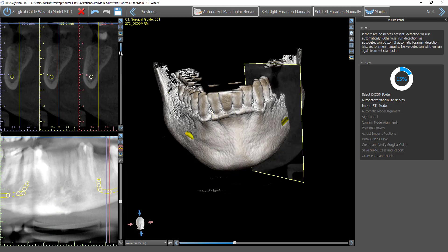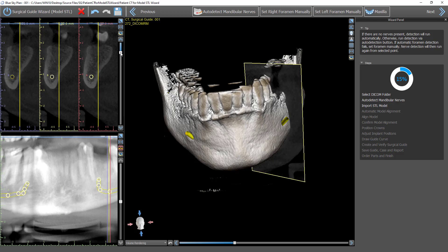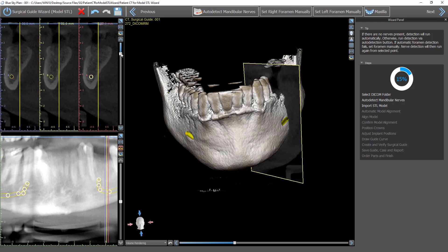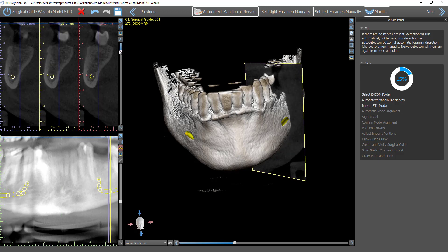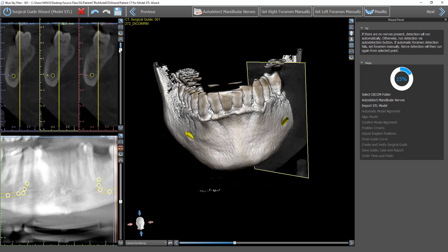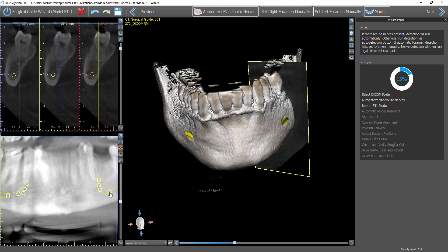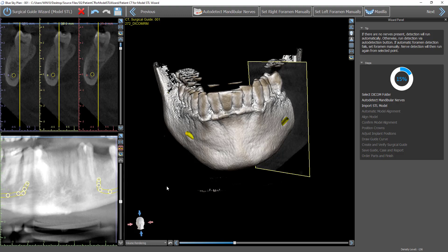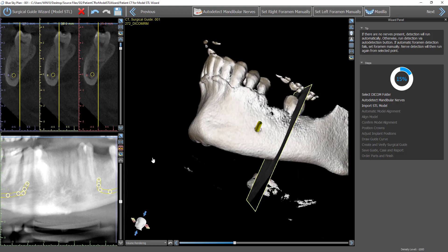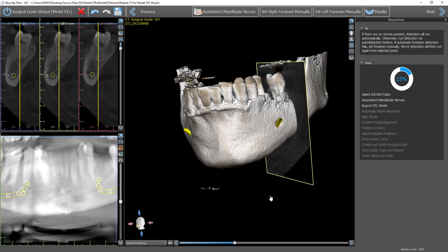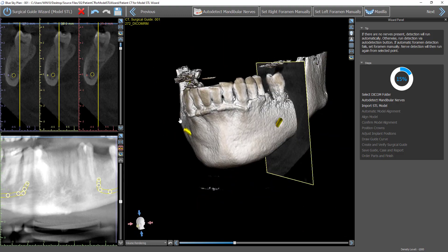We could confirm the placement in our panoramic and in our axial slices. If any modification is necessary, that's no issue. Just grab and drag any of the nodes and make the modification. But we see that the nerves are detected automatically and quite accurately.